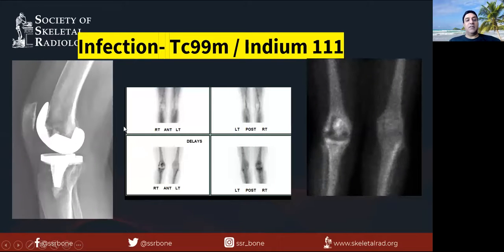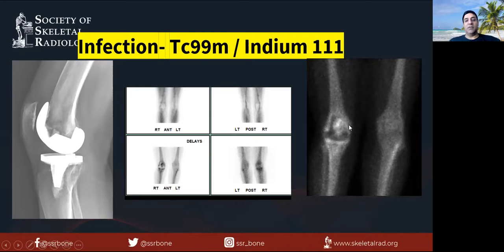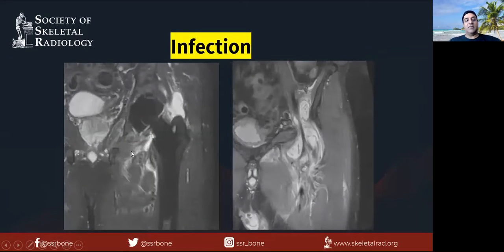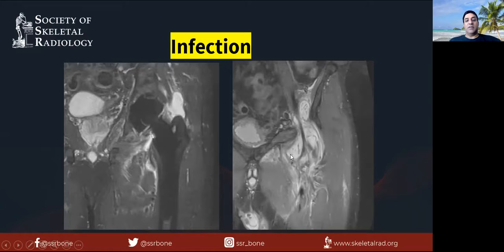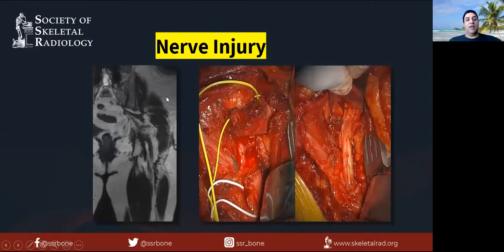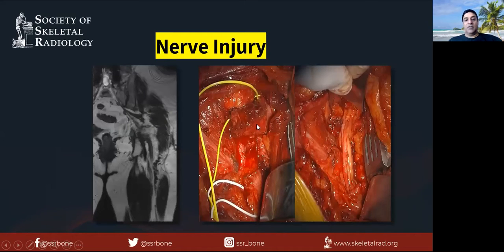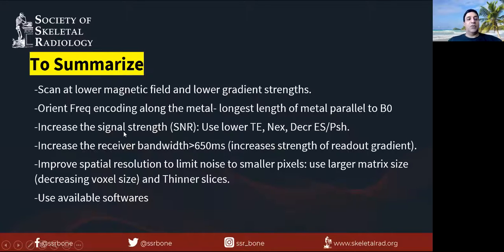For infection cases, clinical parameters are assessed and one may do Technetium-99m or Indium-111 scanning showing increased uptake around the joint suggesting infection. With MRI it's much easier — you may see increased signal in the fascial planes, pericapsular planes, fluid collections, debris, and layered appearance, all consistent with infection. Finally, neurovascular injuries can also be identified — here you can see a thinned-out sciatic nerve that was completely transected at surgery and required cable grafting.